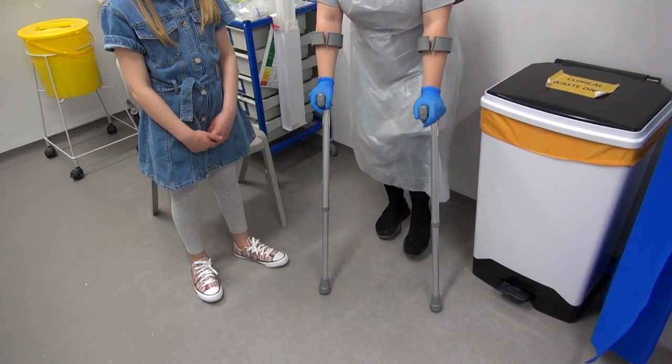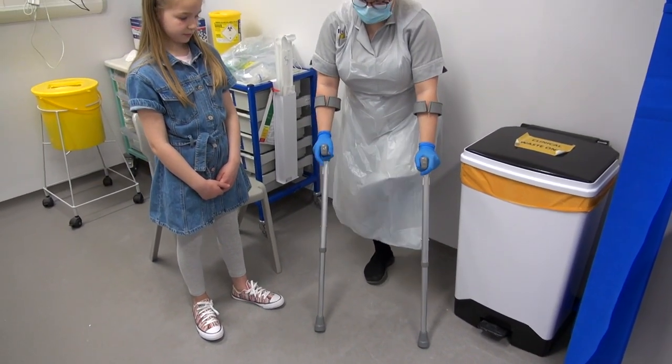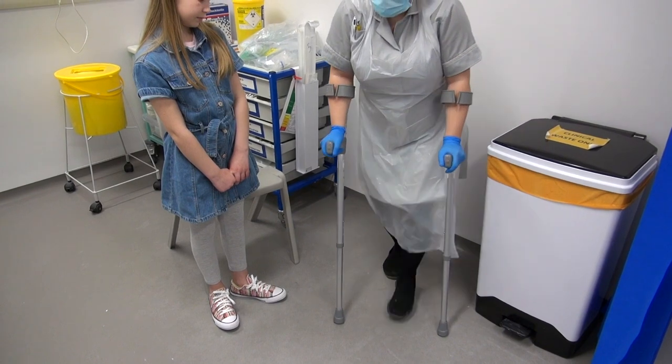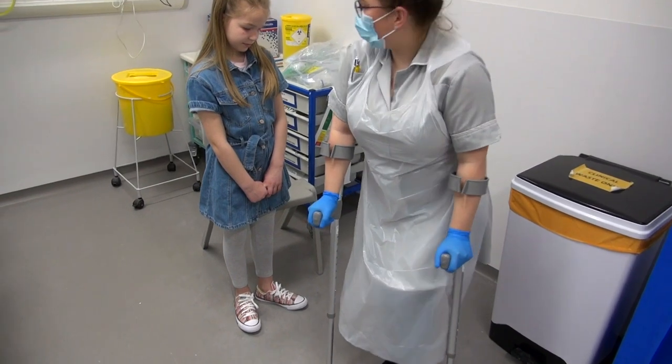With your bad leg, lift that off the floor. Just use your hip so you can bend it or you can keep it straight — entirely up to you. And then hop to the level of the crutches, so just little baby hops. Crutches forward, and then little baby hops.